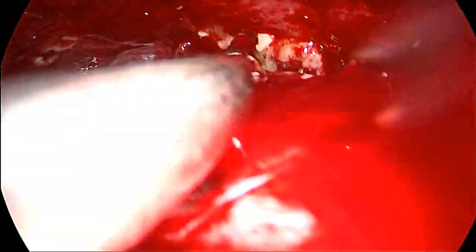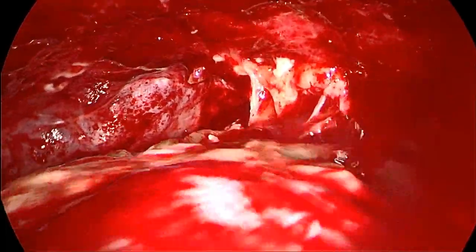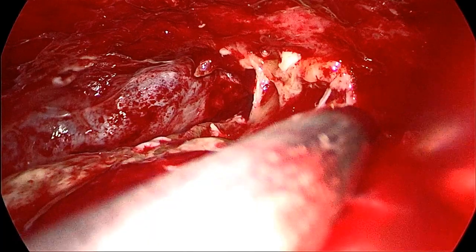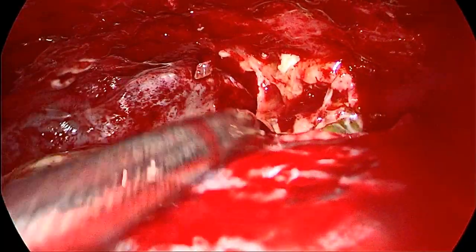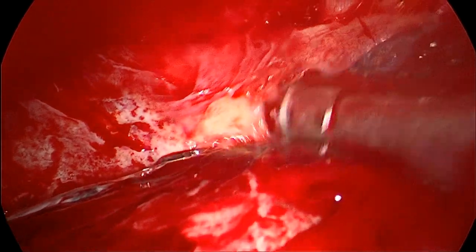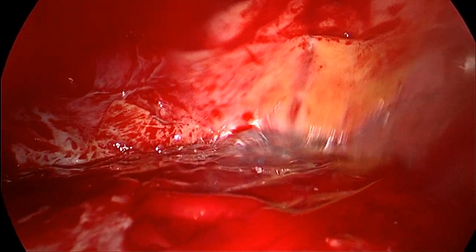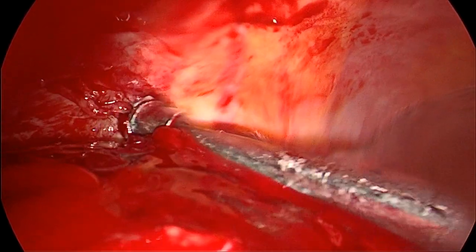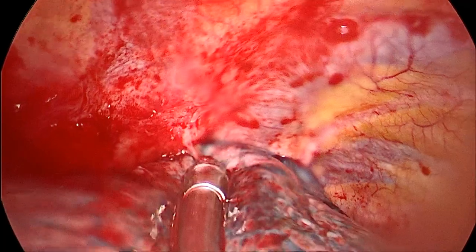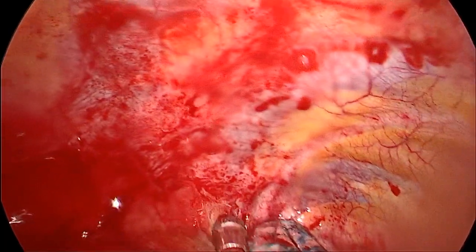With the suction, we try to break down the biofilm and the loculated collection of pus. Then with the aid of a ring forceps, we grasp the largest areas and take it out. We move cranially until we reach the apex of the lung.